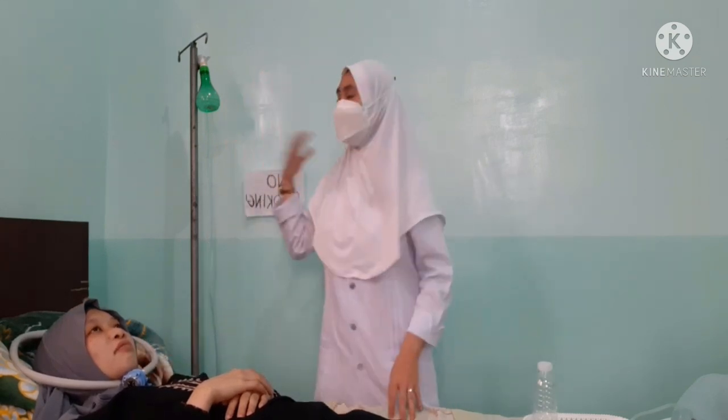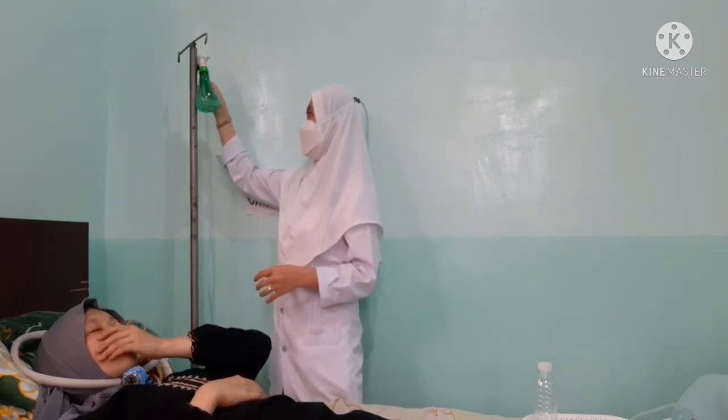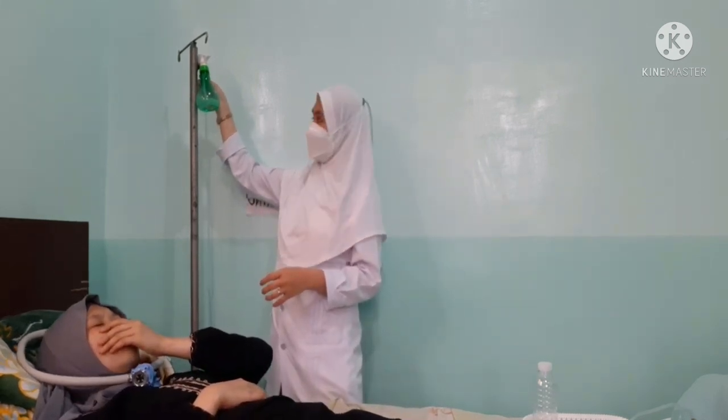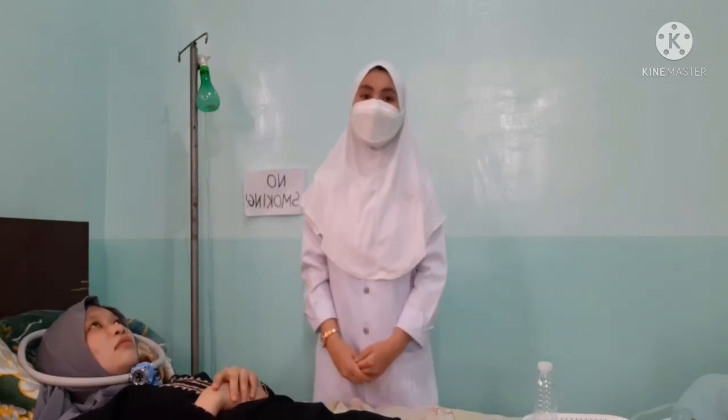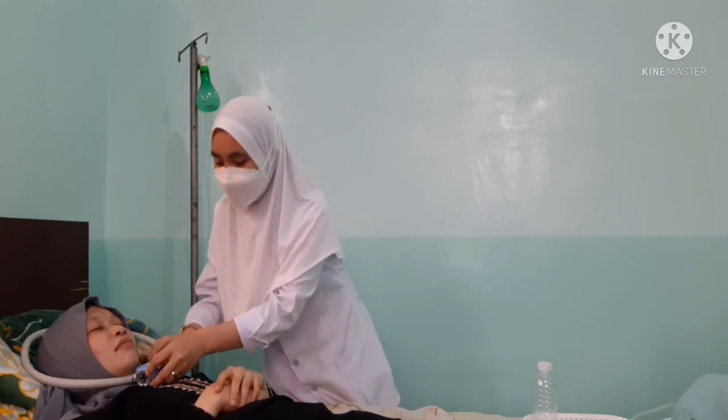Now adjust the oxygen rate to 10 LPM or as prescribed by the physician and adjust the nebulizer to the FiO2 setting. Set oxygen flow rate and concentration as ordered. Now apply the tracheostomy collar so that it loosely covers the patient's tracheostomy. Place the collar's opening directly over the patient's tracheostomy tube.